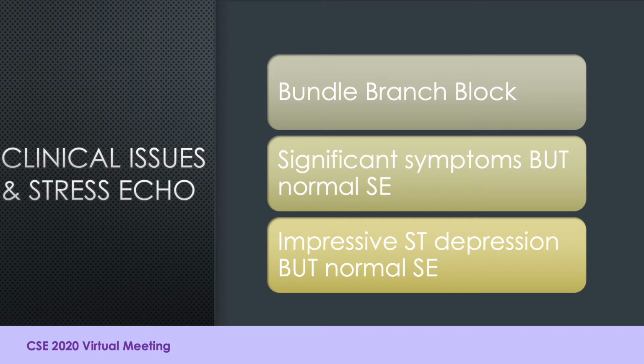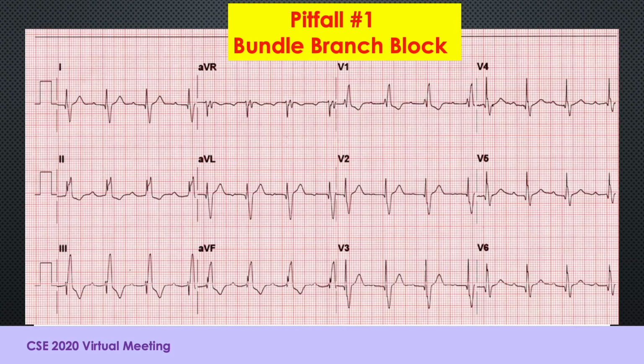When one looks at clinical issues with stress echocardiography, I thought I'd highlight the bundle branch block, significant symptoms but a normal stress echo, and an impressive ST depression but a normal stress echo. Pitfall number 1, a bundle branch block.